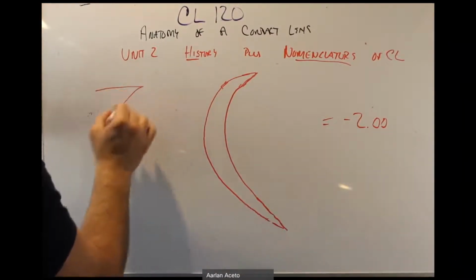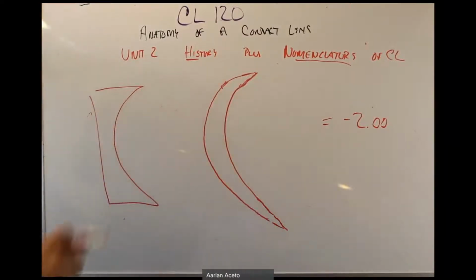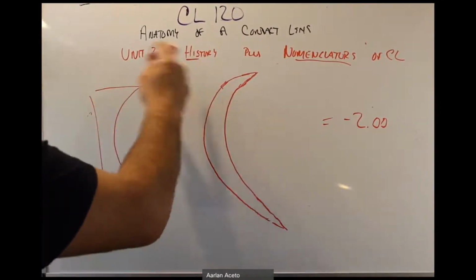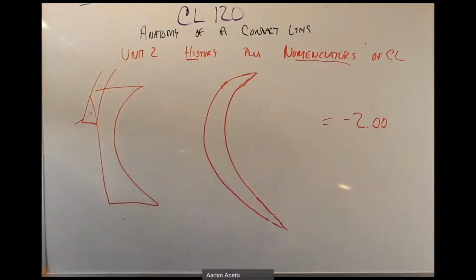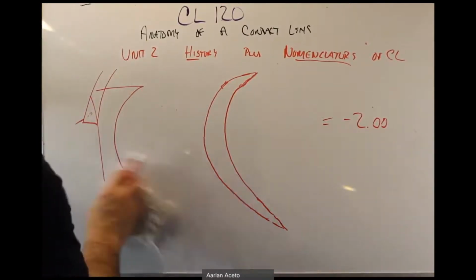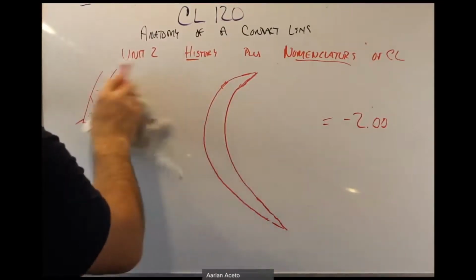Now in an eyeglass lens, we have these sharp edges for a minus lens. We have these sharp edges for a plus lens. Well, you don't want to put a contact lens on somebody's cornea that's got sharp edges like this. That's just not how this works. When the person's eyelid blinks and goes over this edge, we don't want there to be big bumps here. So there are some adjustments we have to make sure that the contact lens fits well and follows the eye anatomy.